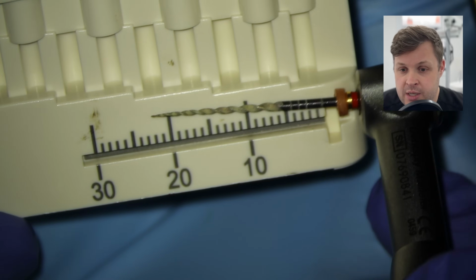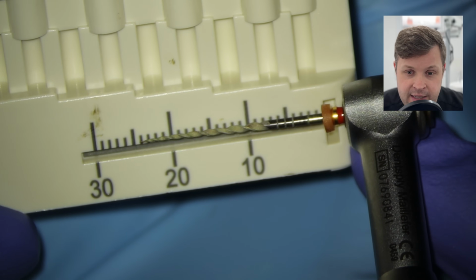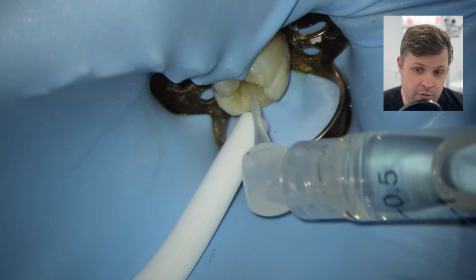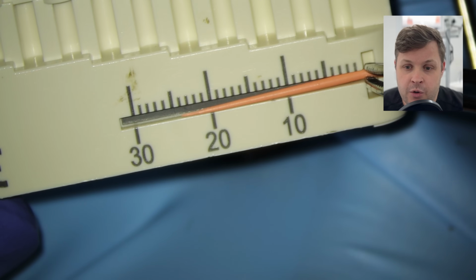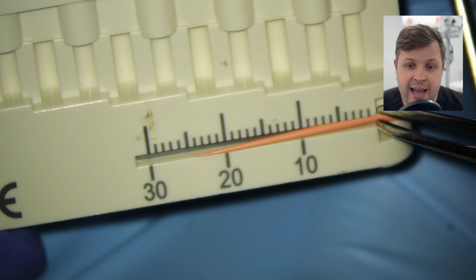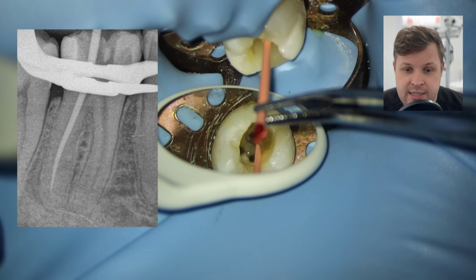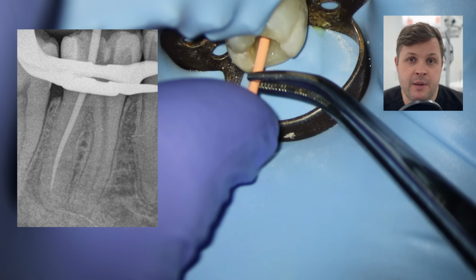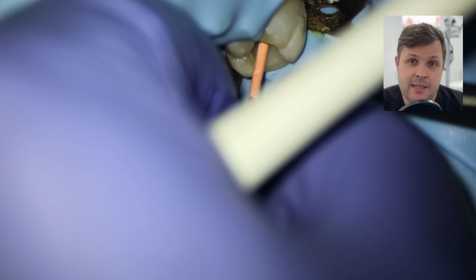So I'm going to use my size 25 variable high flex now to 24. So I'm going to shape it to 24, rightly or wrongly. And then I am going to place another GP cone in the distal canal at the 0 reading. And then when we take the radiograph, we can see that this still looks like a million miles away from the radiographic apex.